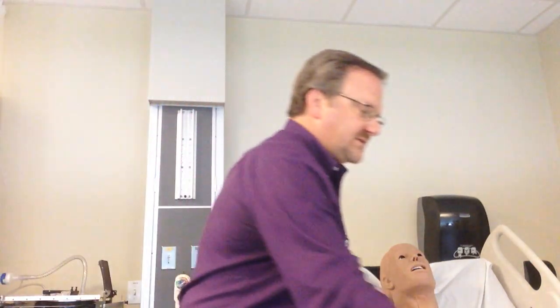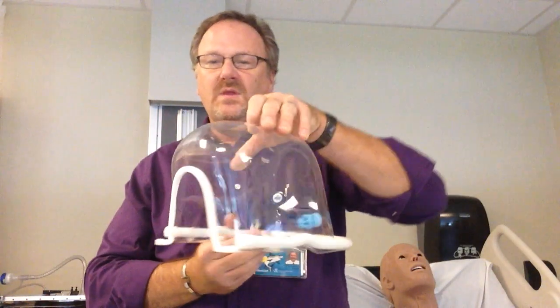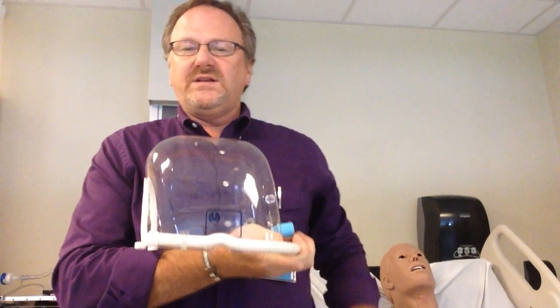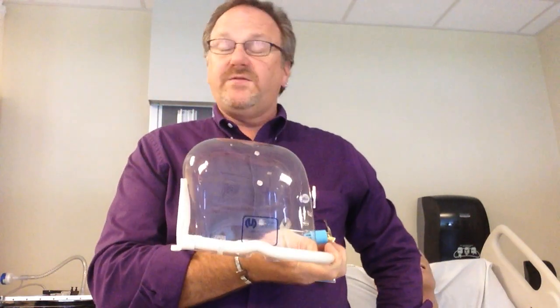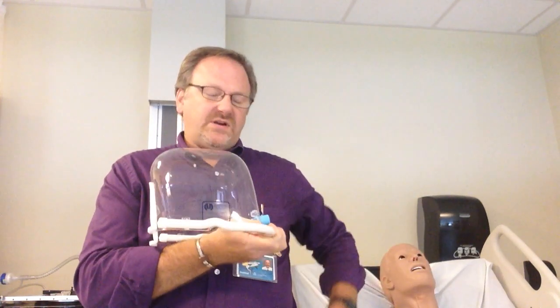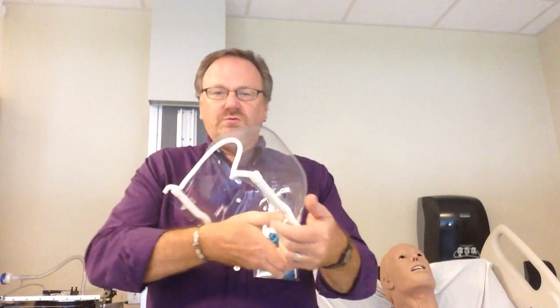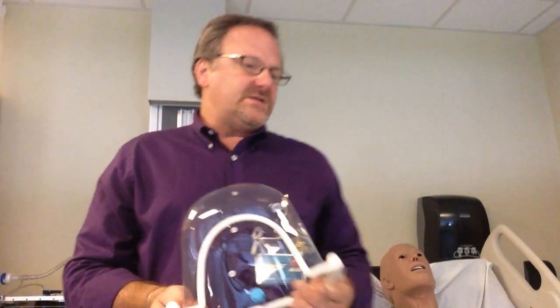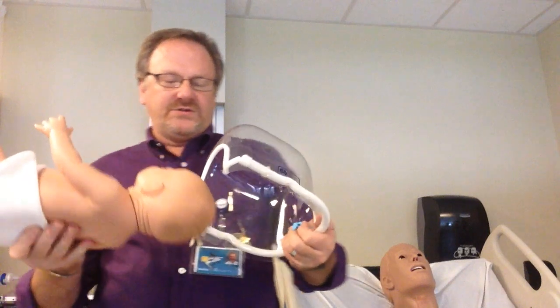The oxy hood is a device used for babies. You want at least seven liters per minute going through — not the 40 to 45 liters mentioned for adults. It has a diffuser so that the air is not hitting the baby directly. This would have to be heated, because babies cannot regulate their temperature as well, so this would have to be a heated aerosol.